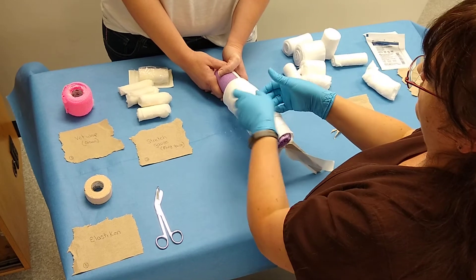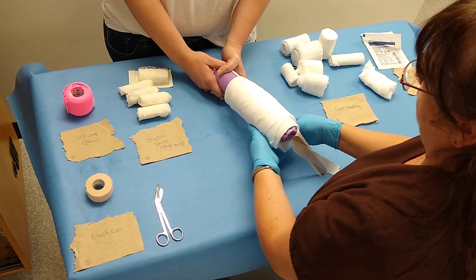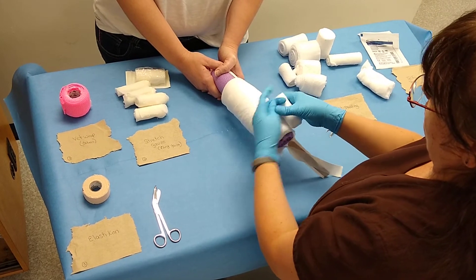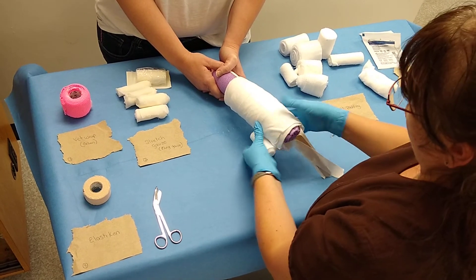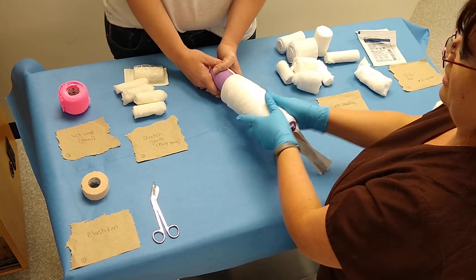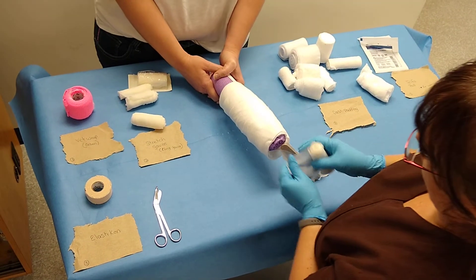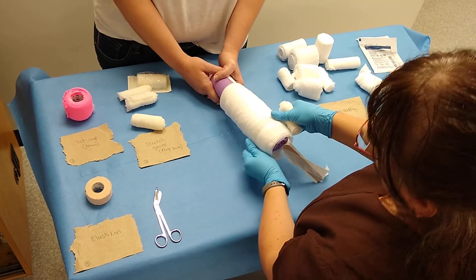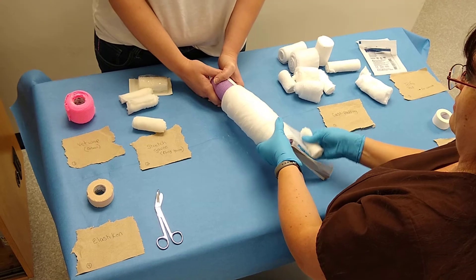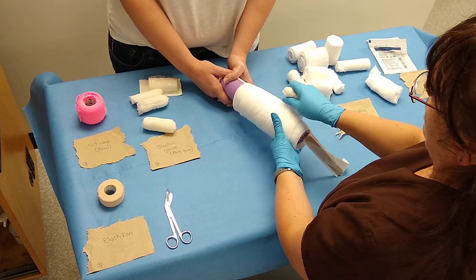Once you have several layers of padding on your dog's foot, you're going to apply your stretch gauze. You're still going to want to make this snug, and you're still going to want to overlap 50%.